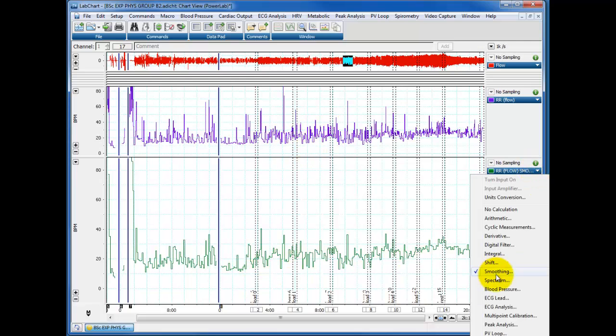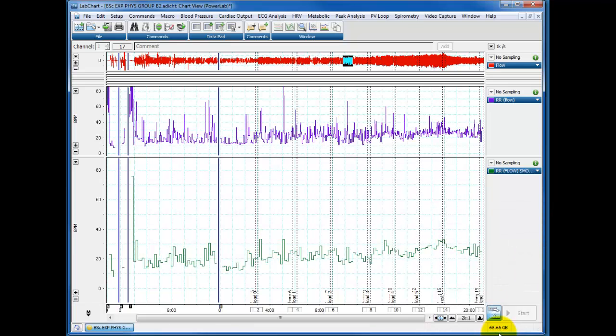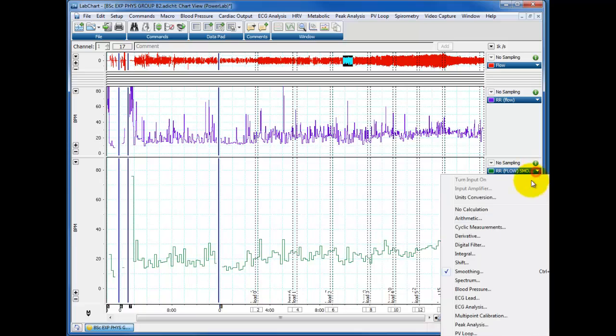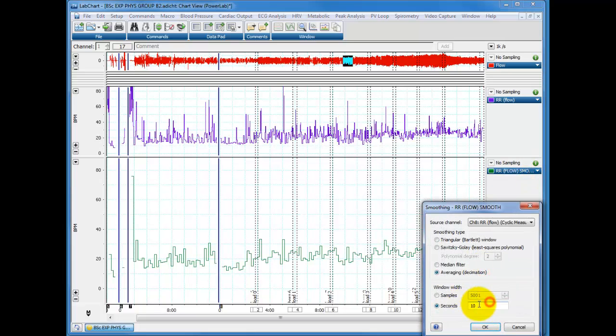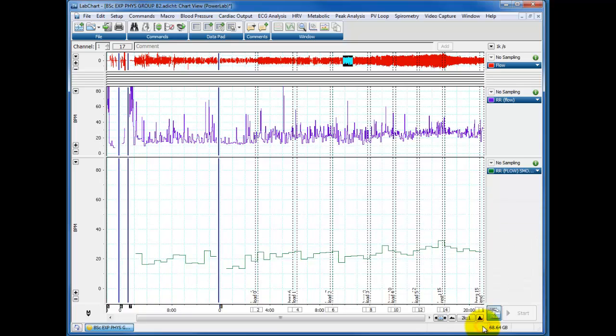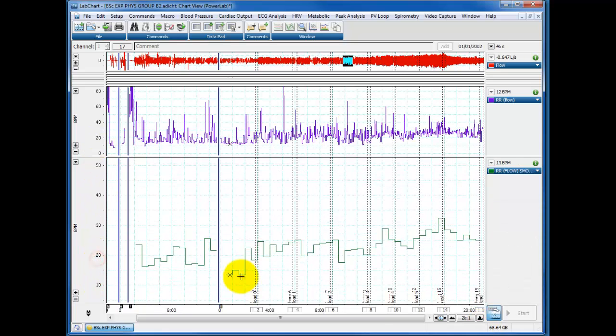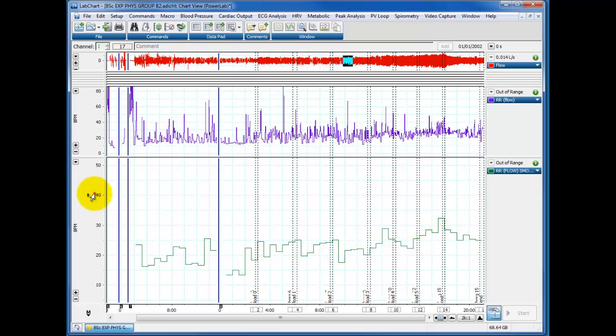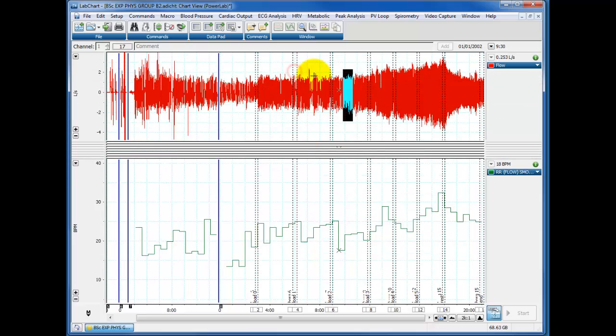And you can change this smoothing and you can bin it into ten second bins, for instance. And again, you can see trends and we may end up, just for the visualization, bin it into thirty second bins. And you can see here quite clearly now there is an absolute trend for respiratory rate to increase over the time course of this practical.